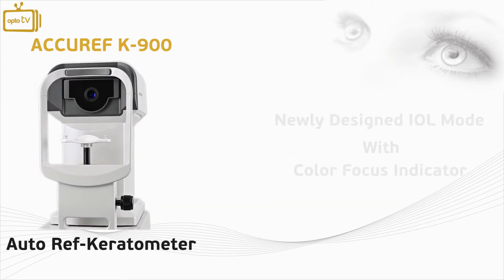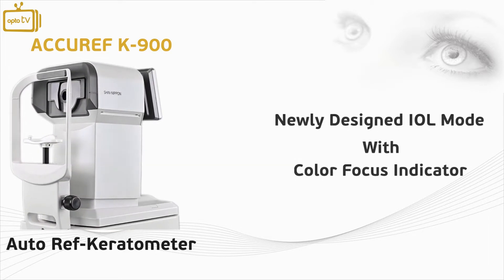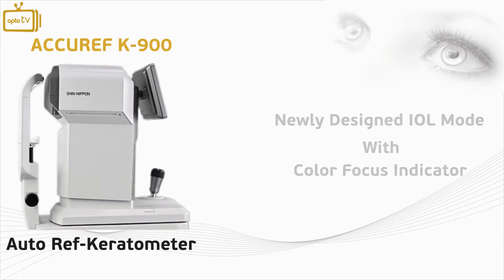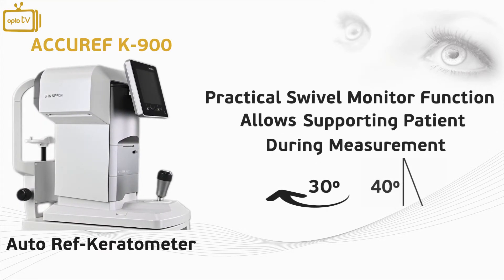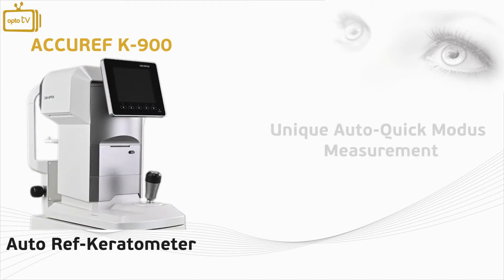With its newly designed IOL mode, the instrument provides a color focus indicator that assists the user to measure easier patients with IOLs. A 30 degree swivel function to the left and a 40 degree vertical tilt have been added to the monitor unit to help the user support the patient during measurements without distractions.